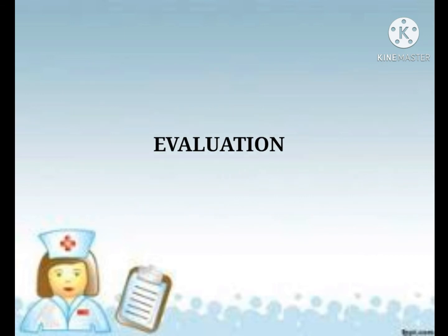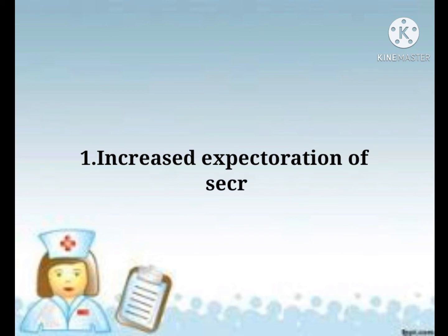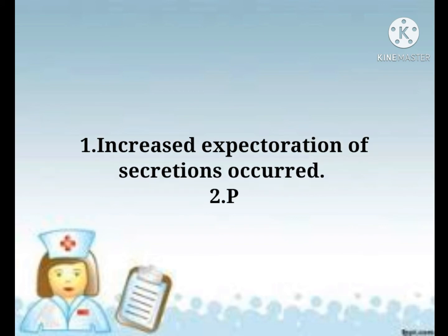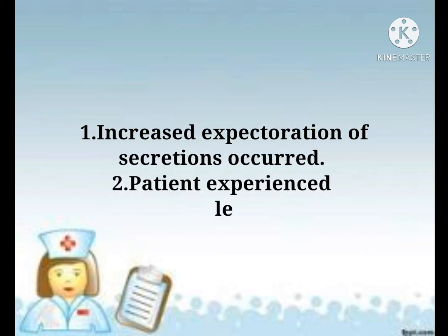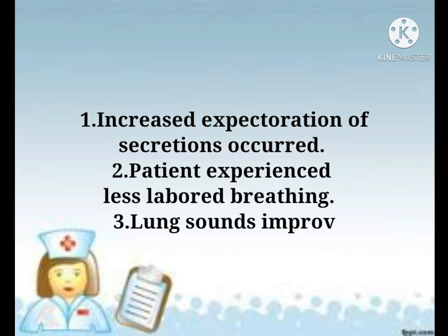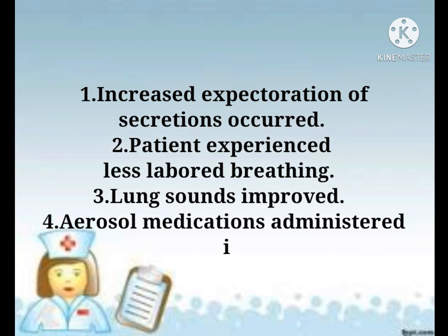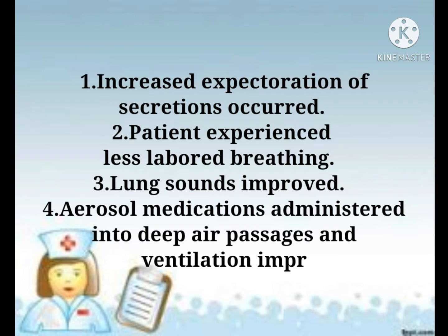And for the evaluation, the nurses should evaluate if there is an increased expectoration of secretions, if the patient experienced less labored breathing, lung sounds improve, aerosol medications are administered into deep air passages, and ventilation improved.